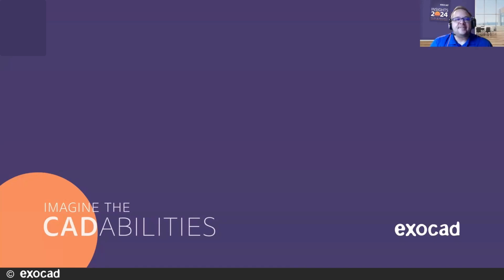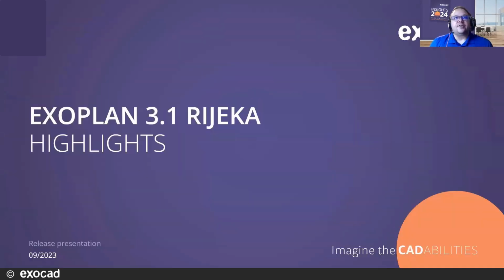Go ahead and start off with our PowerPoint here. So today we're going to just cover some highlights with exoplan Rijeka 3.1.